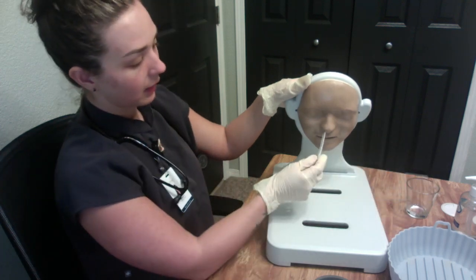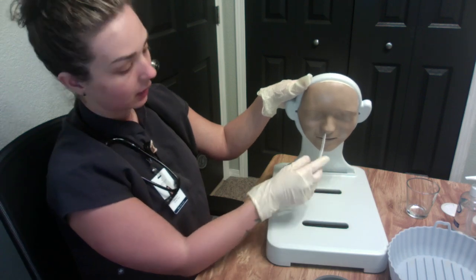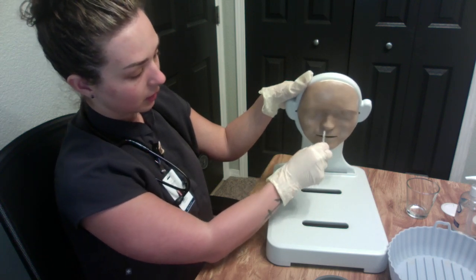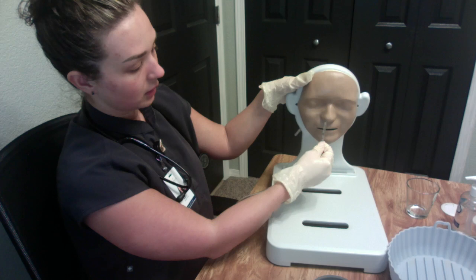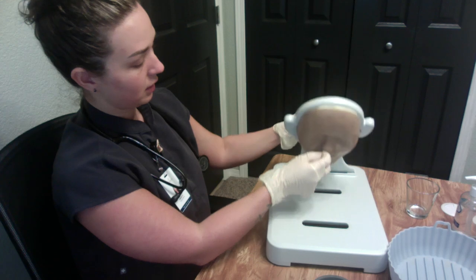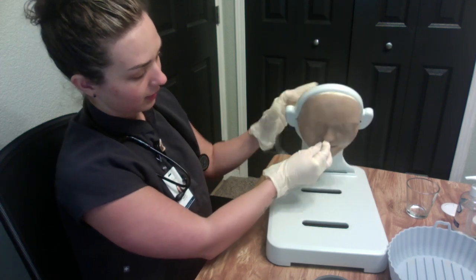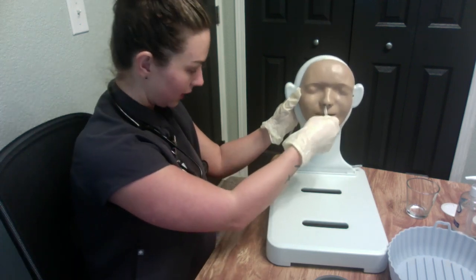Now each time that I continue to push 5 to 10 centimeters, I'm going to ask the patient to swallow. So go ahead and swallow. Swallow. Good. Swallow. Good. Swallow. Good. Swallow. Good. Okay, so we've hit the 50.